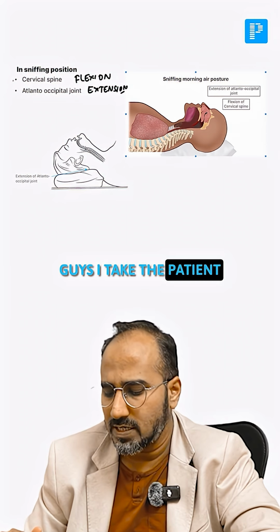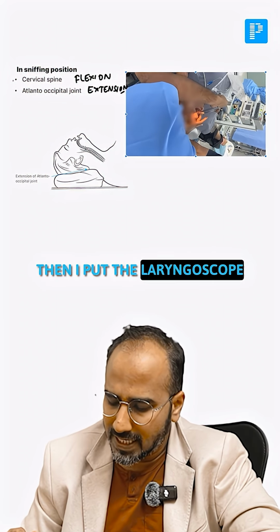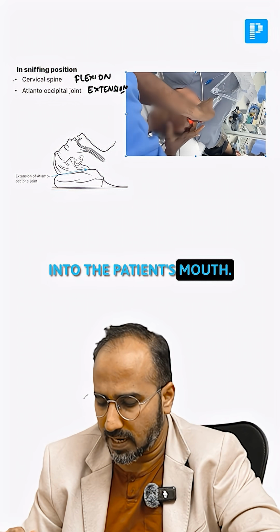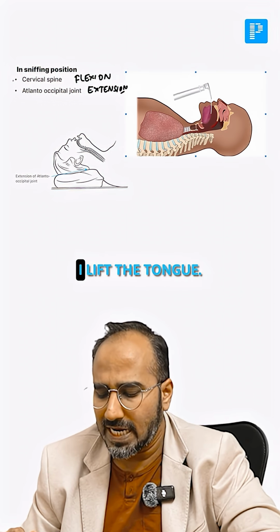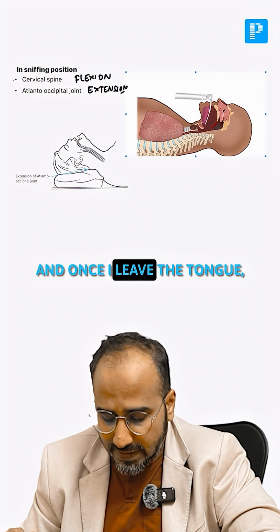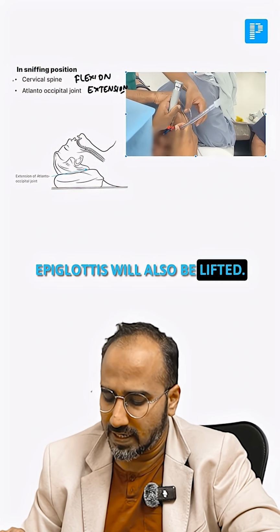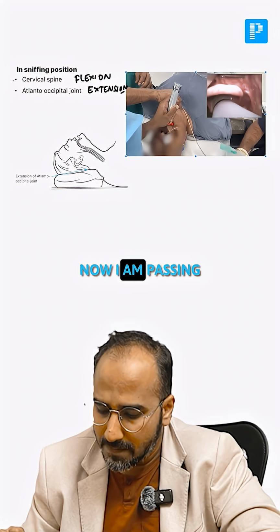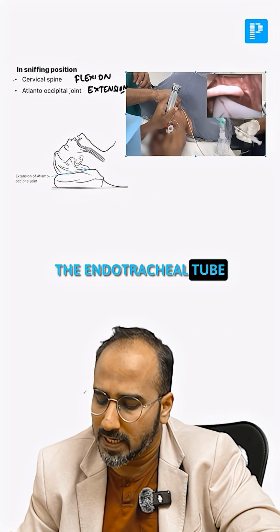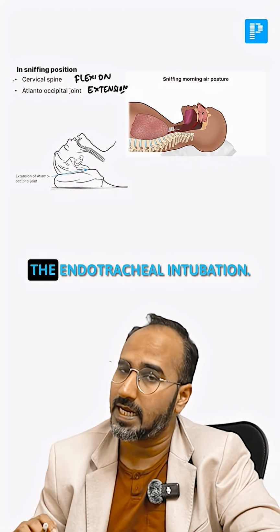I take the patient in a sniffing morning air posture, then I put the laryngoscope into the patient's mouth, right? And once I put the laryngoscope into the patient's mouth, I lift the tongue, and once I lift the tongue, the epiglottis will also be lifted. Once I see the epiglottis lifted, I will see the vocal cords. Under vision, now I am passing the endotracheal tube through the vocal cords. Okay, that's regarding what, guys? That's regarding the endotracheal intubation.